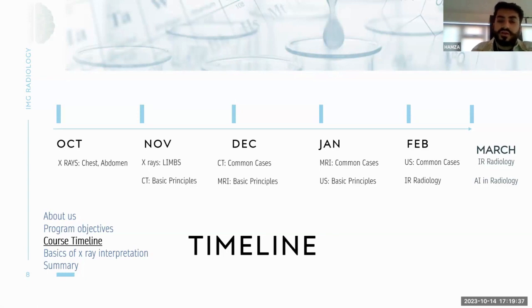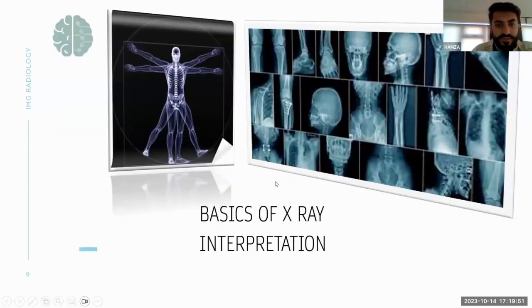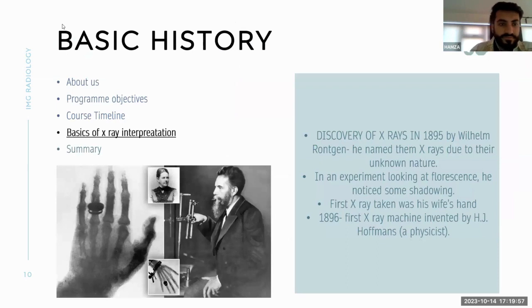Then we'll be talking a little bit about the influence of artificial intelligence in radiology, the current uses of artificial intelligence in radiology, and what the future of radiology is like with AI involved. Okay, all right, so we're going to move on to basic interpretation of X-ray. Over to you, Karthik.